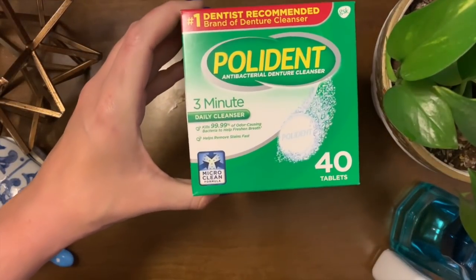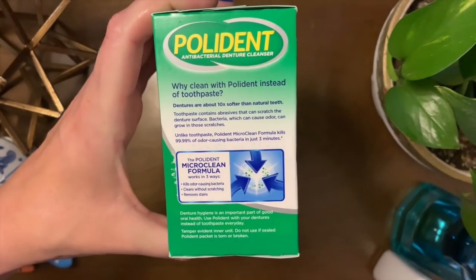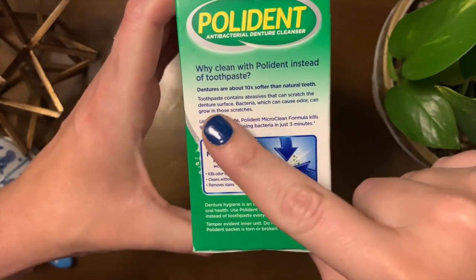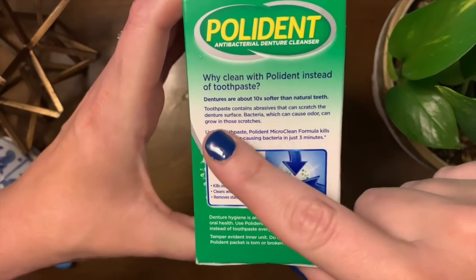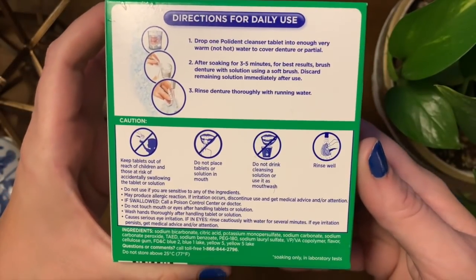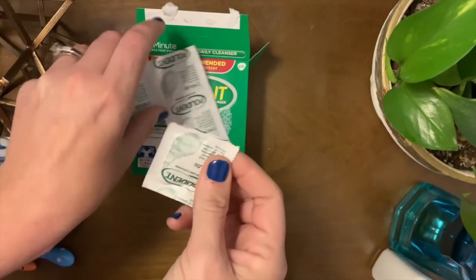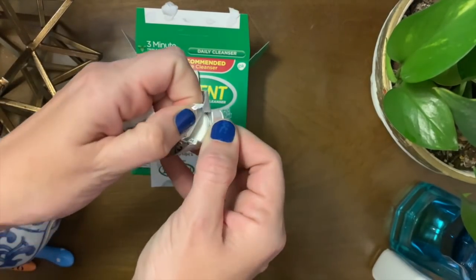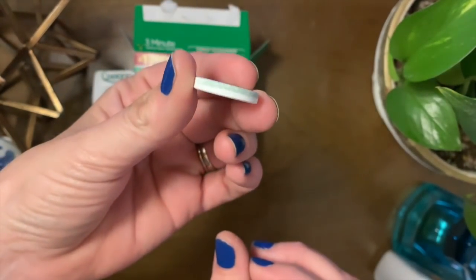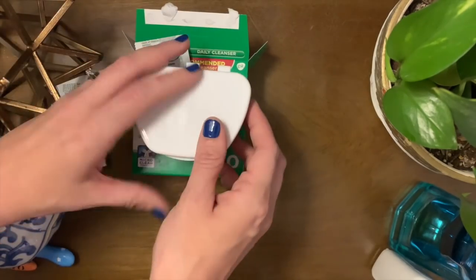Then I got the Polydent tablets — these are the three-minute daily cleansers. I wouldn't just soak my dentures for three minutes; I'm not quite sure why they advertise that, because it definitely takes longer to soak your dentures to make sure you're really penetrating into those microscopic scratches that collect stains and bacteria. It's a good tablet to use. You take a tablet out, put it into the denture bath, put your teeth in there, fill it with water, close it, and soak it overnight — or the dentist-recommended six to eight hours — to kill all odor-causing and stain-causing bacteria.